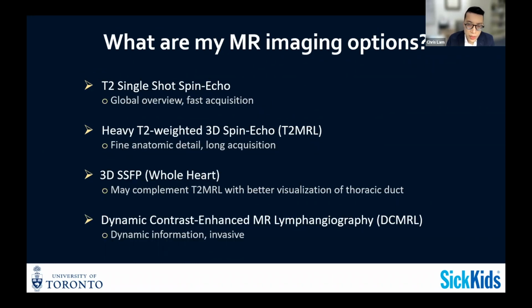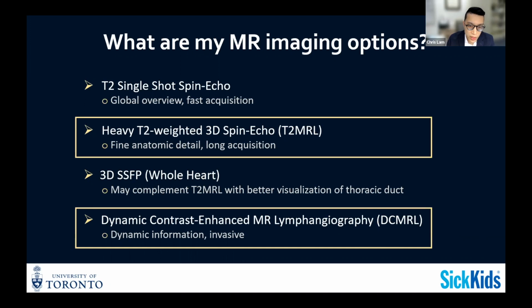What can we use to image lymphatics? There are a lot of different MRI sequences that have been described, but the main ones that people think about when you talk about MR lymphangiography would be this heavy T2 weighted.